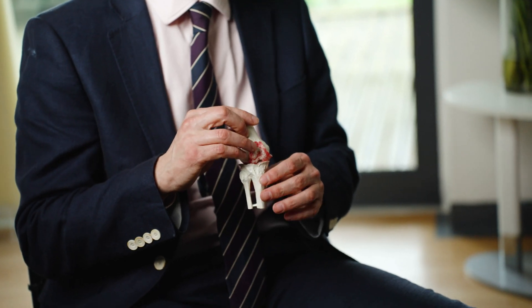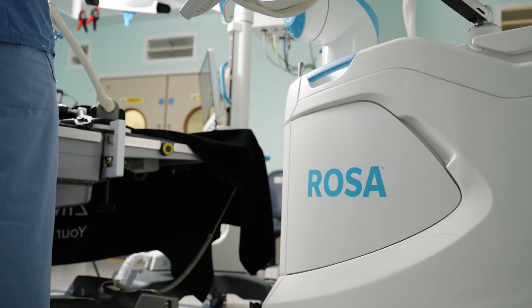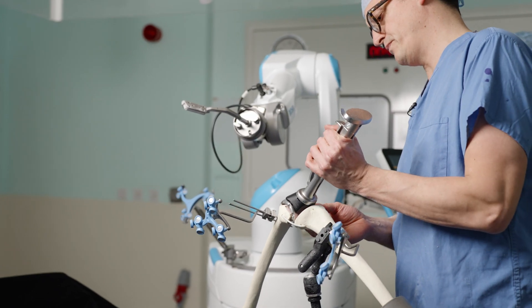Traditionally what we would do is use a generic jig that fits everybody. But as we know, not everybody has got the same anatomy, same bone shape, same alignment or ligament balancing of their knee. With the robot, we can assess these parameters in real time during the operation using various sensors picked up by the robot. We can then devise an optimal plan and execute precise cuts using the robotic arm to give us the perfect sizing, placement, alignment and balancing of the knee.